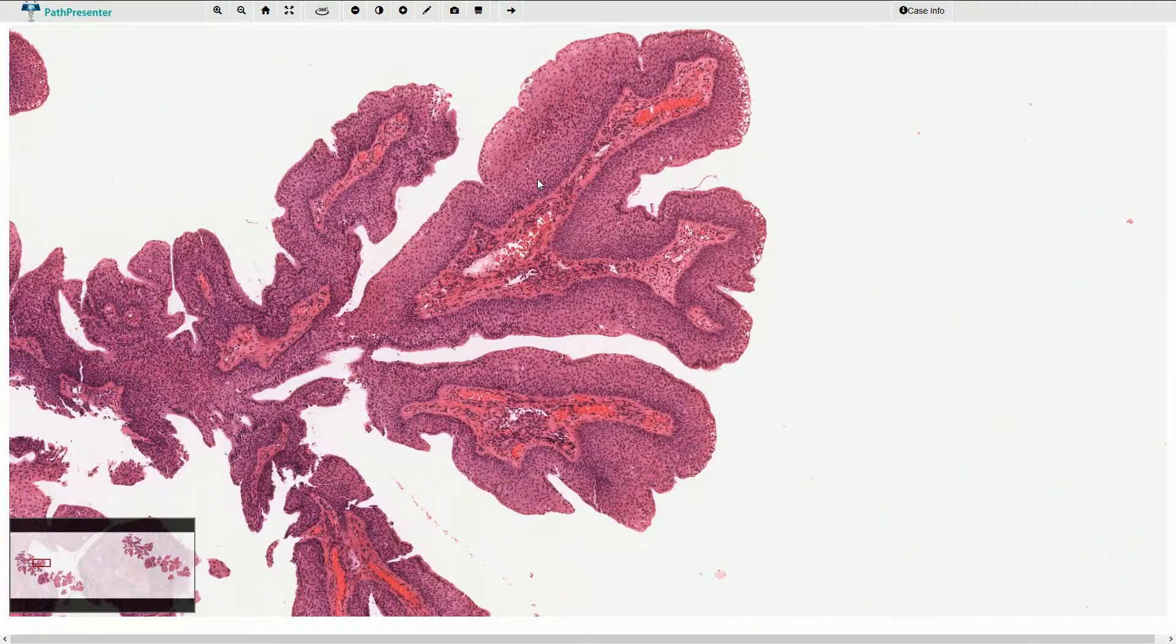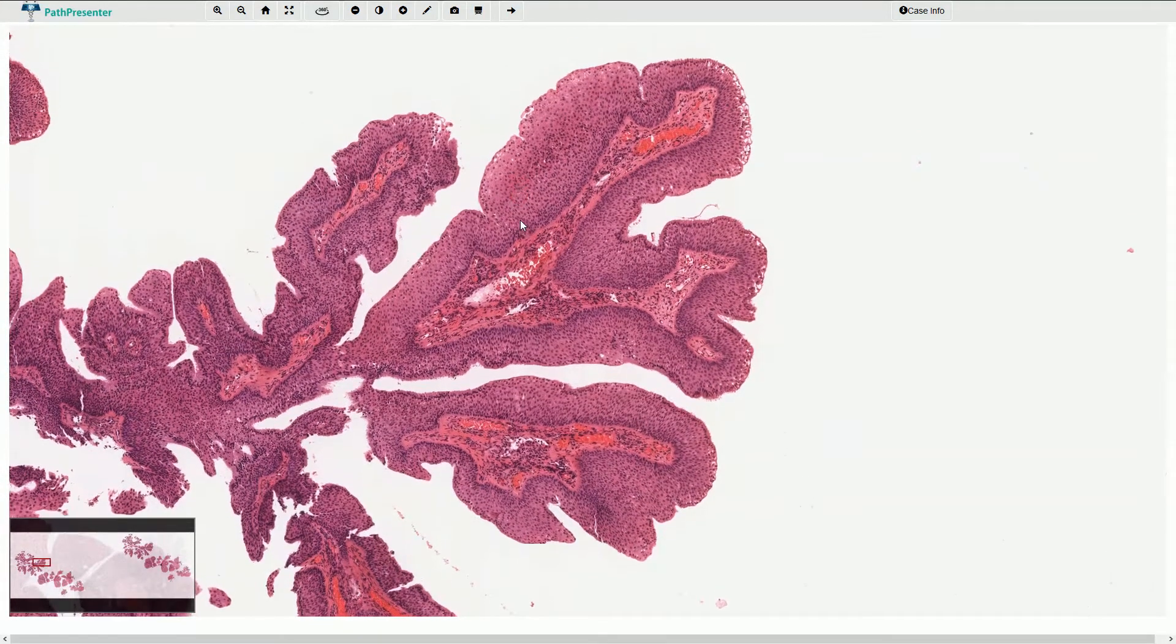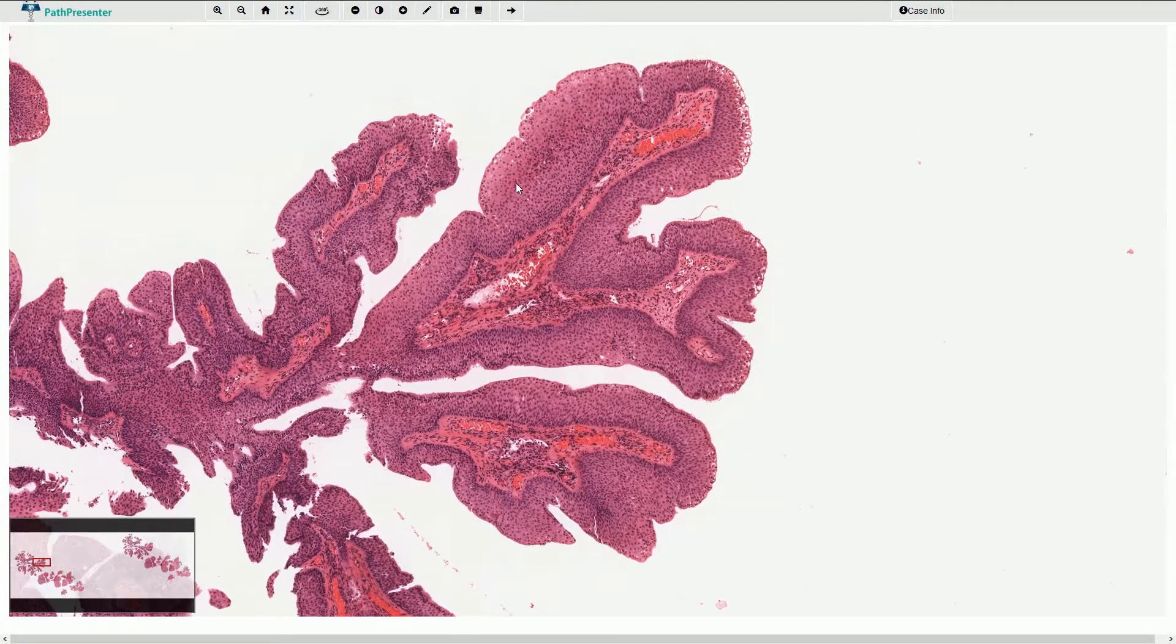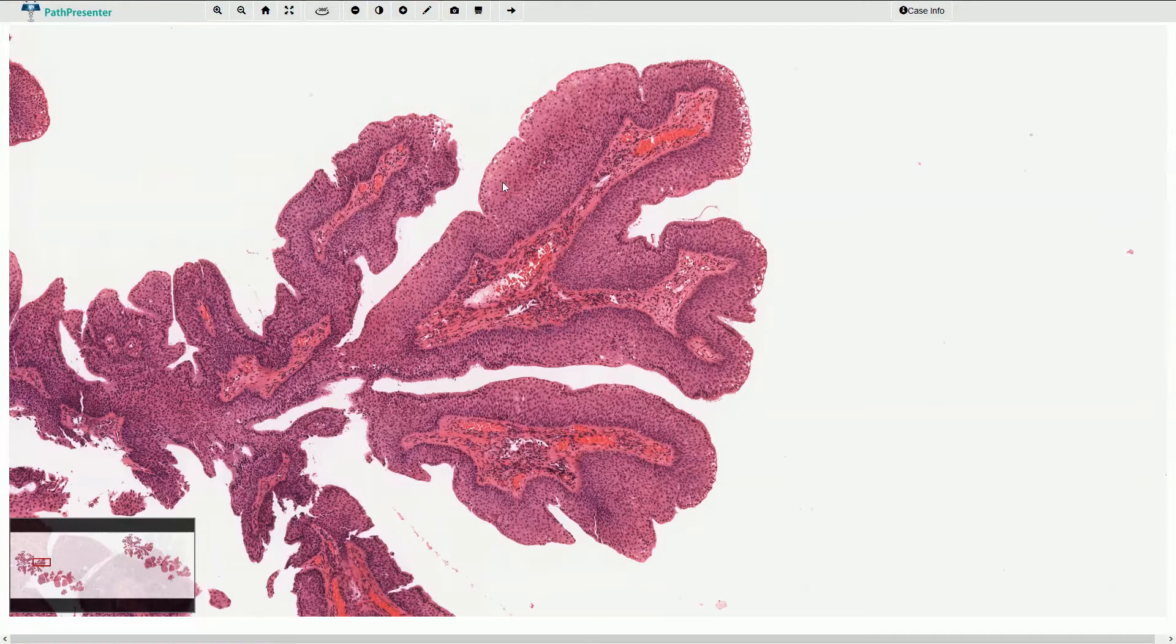The stratified squamous epithelium is bland without any cytonuclear atypia. We can appreciate nice maturation toward the surface.